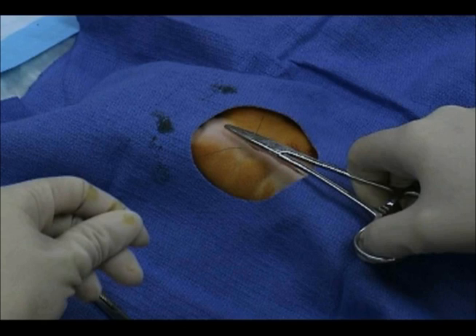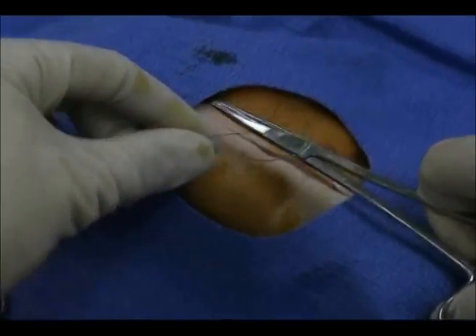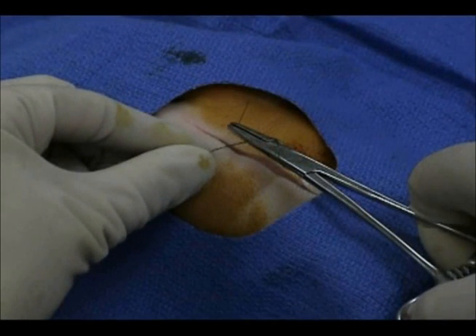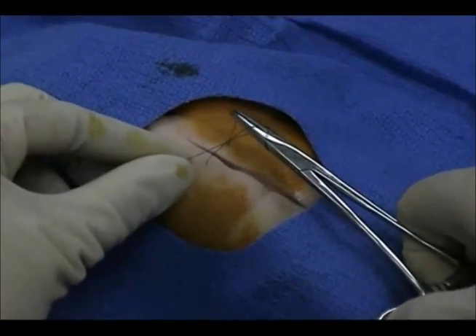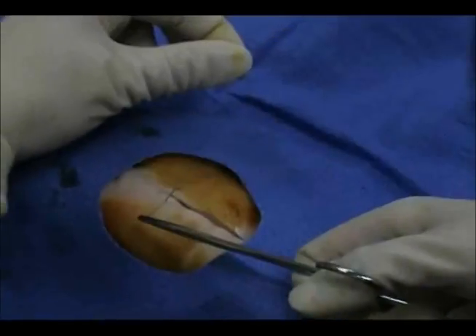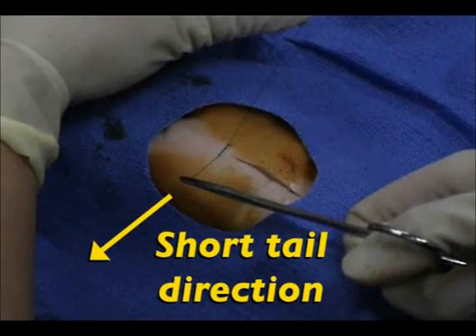The first knot is a surgeon's or double throw knot. To do this, loosely wrap the longer tailed suture twice around the tip of the needle driver. Then, using the needle driver, grasp the tip of the short tail. Pull the short tail through the double loop that you have created until the short tail now points in the opposite direction that it started. This will require crossing your arms. As you tighten the knot, it should lay flat and even along the wound.